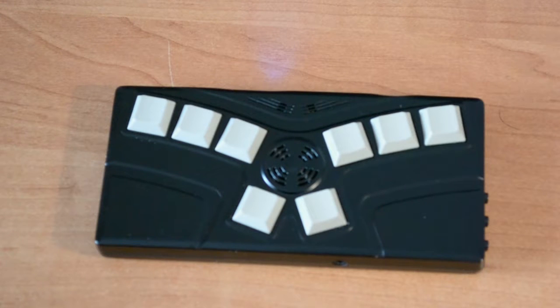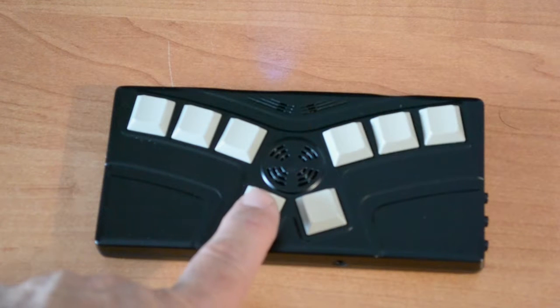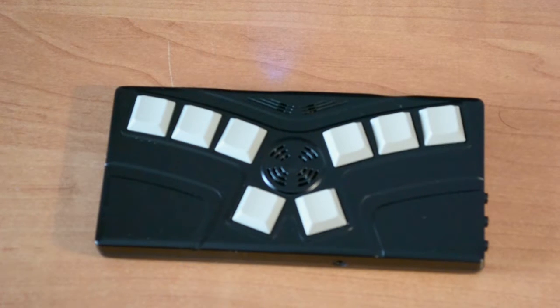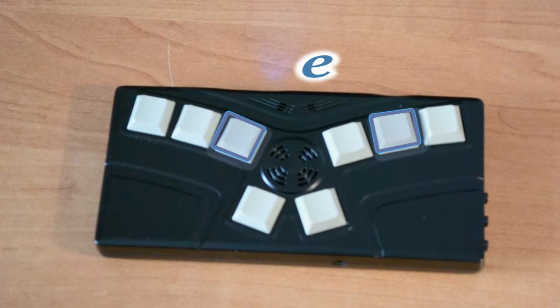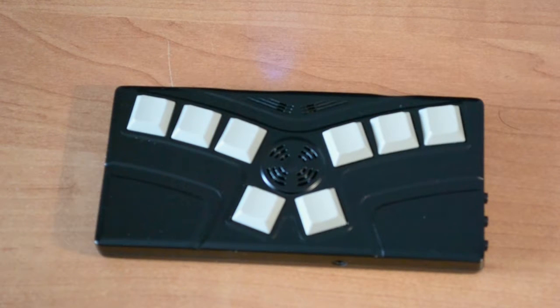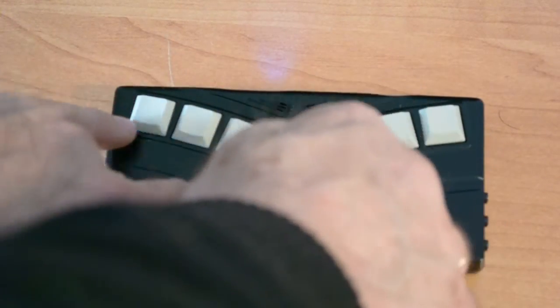We have this device on the list, and the name of this device is IBAI. Pressing the left or right key, we can go through the list of devices, and at this time we have only one device because we have added this computer. The name of the device is not very nice. We can change it by pressing the letter E, dots 1 and 5. Insert new name. And now we can type the new name for this device. Let's change it to my computer. M-Y.